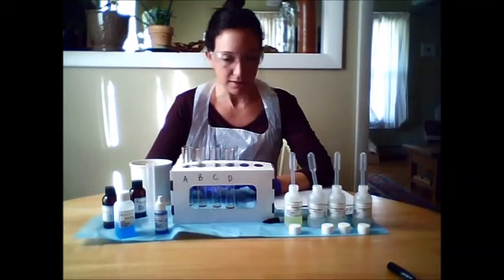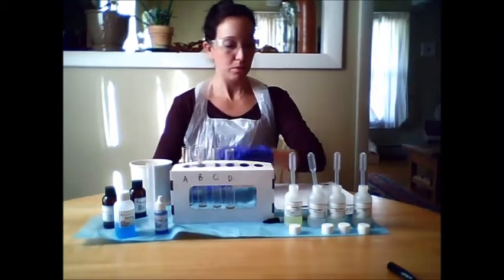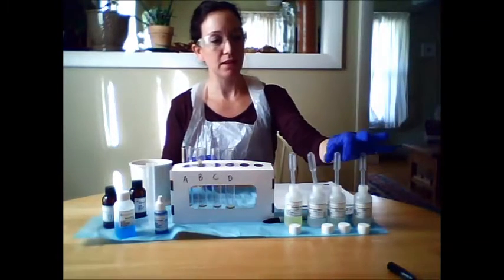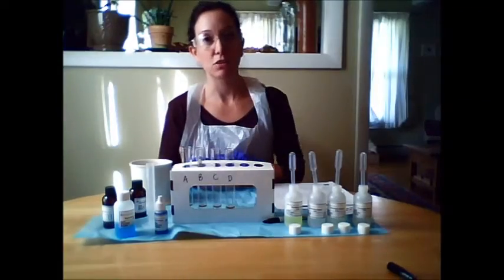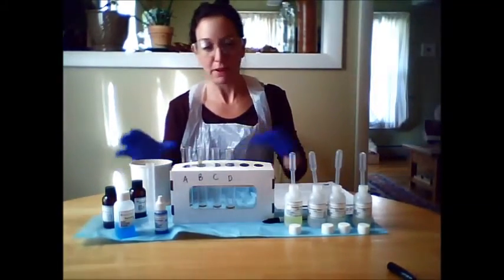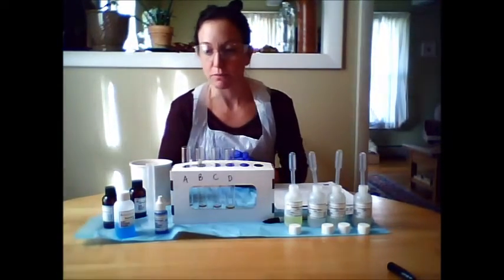The next part of the test is the glucose test. And with this, we will be using the same urine. I just have pipettes in the urine themselves so that I don't have to waste pipettes. That way I can use the same pipette for each experiment. As long as I don't interchange the pipettes, I won't have cross-contamination.